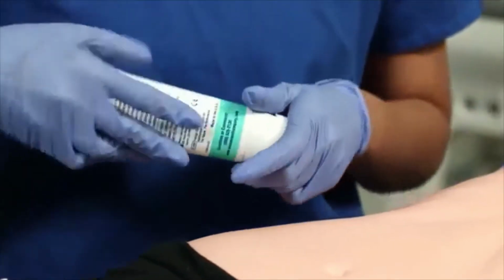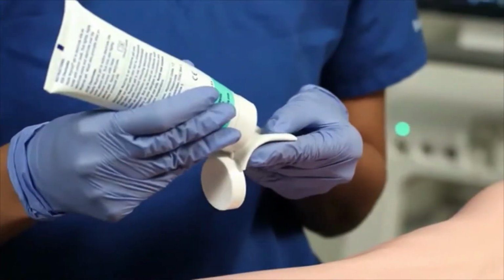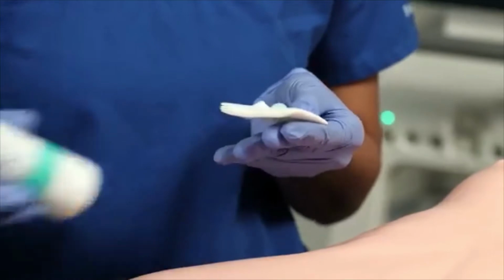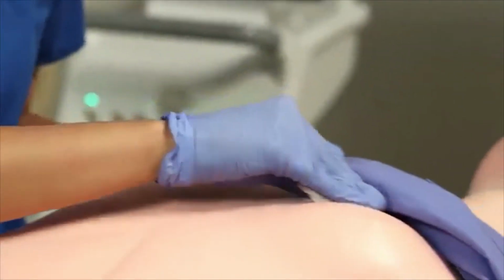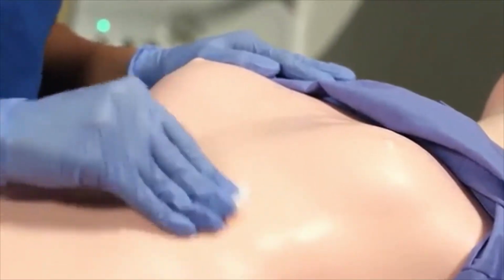After the patient is shaved, use the skin prep gel on the areas where the quattrodes will be placed and briskly rub the selected sites with the gauze pad. The skin may turn pink. This gel is an exfoliator and gets rid of dead skin cells.